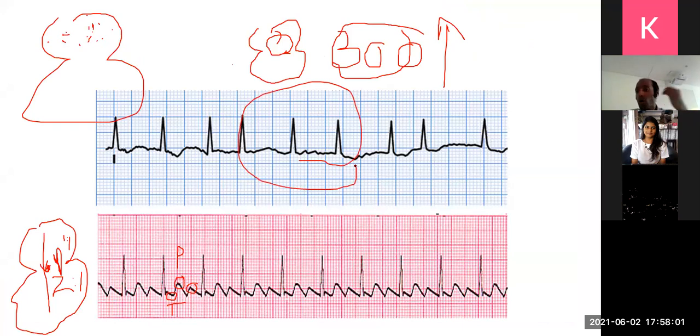I will teach this when you talk about tachyarrhythmias when you come to Professor Oren's emergency medicine. But essentially, the rate has nothing to do with the diagnosis of AF. It can be slow or fast or whatever. Essentially, AF means abnormal P, normal QRS. Abnormal P is irregular baseline, right? That is what you get.